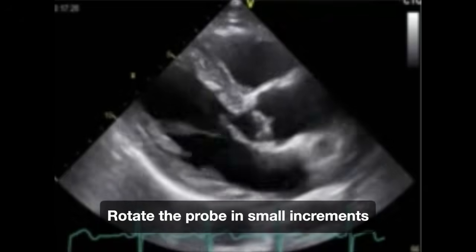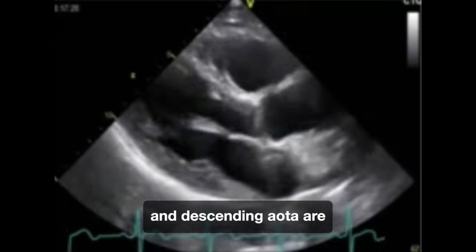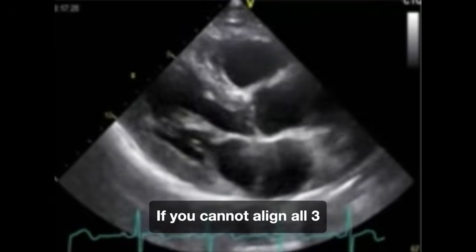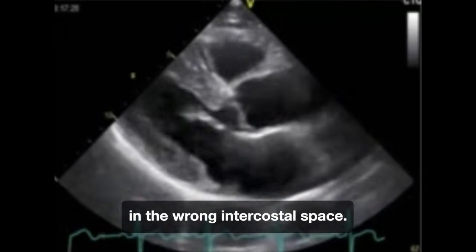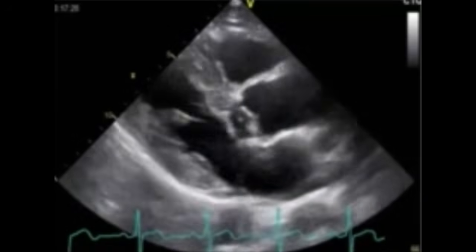Rotate the probe in small increments until the left ventricular outflow tract, mitral valve, and descending aorta are all visible within the same plane. If you cannot align all 3 structures, you may be in the wrong intercostal space. Return to the first correction and reposition the probe.